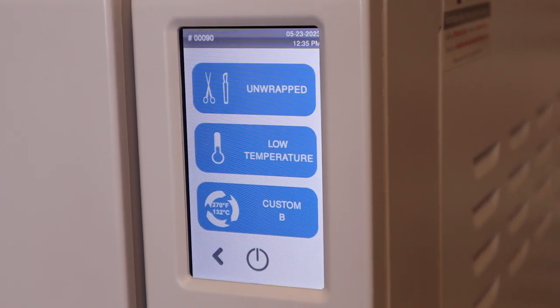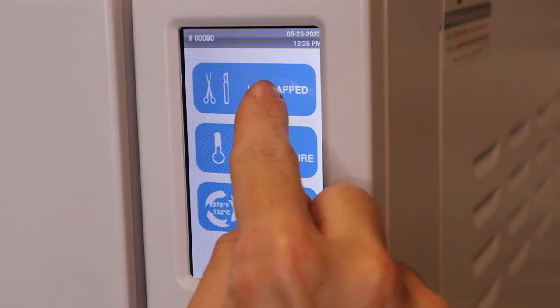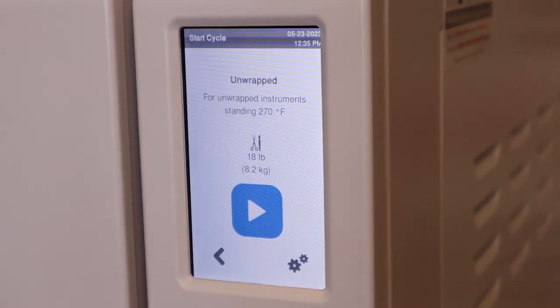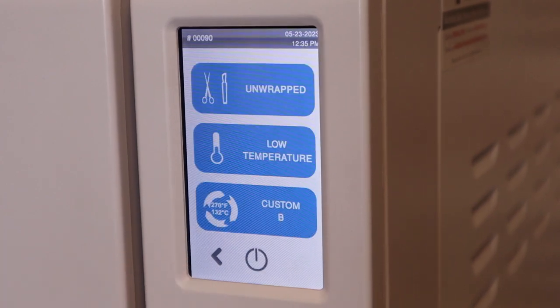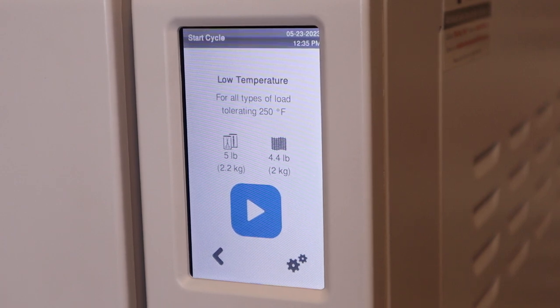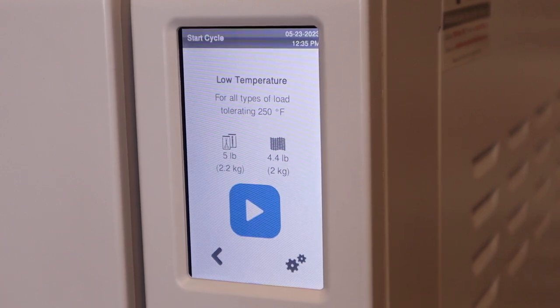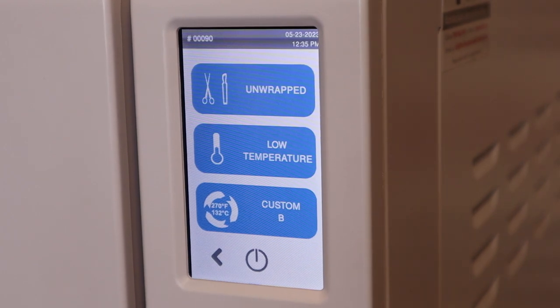Now we're going to move on to the next page. This one's going to have a little bit different cycles. You're going to have your unwrapped instruments at the highest capacity, which is going to be 18 pounds per load, but those instruments do have to be unwrapped, not in packs. Your low temperature cycle — you're going to want to refer to your manufacturer specifications on the tools as far as if they need to be sterilized at 250 degrees or the traditional 270 degrees. Your custom B cycle is not FDA cleared.